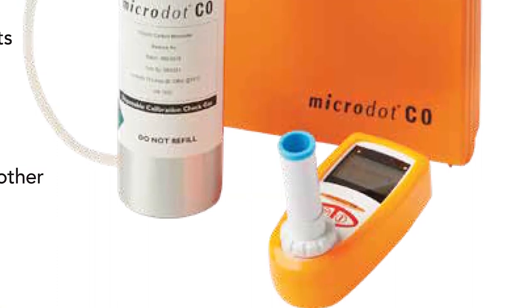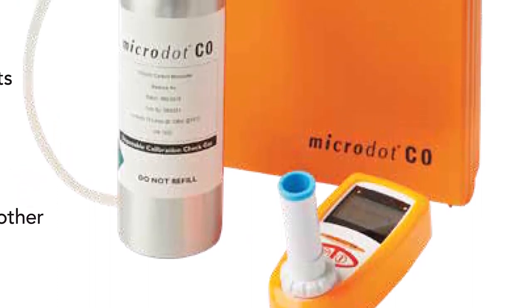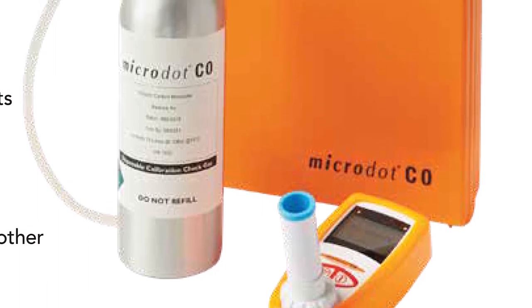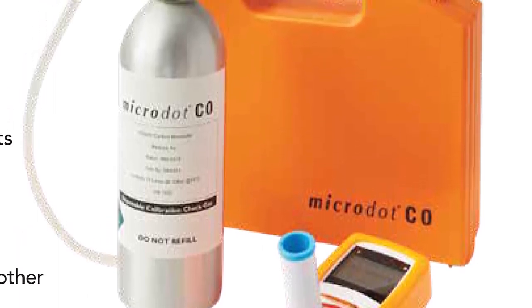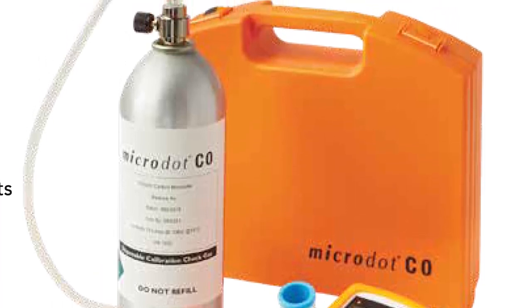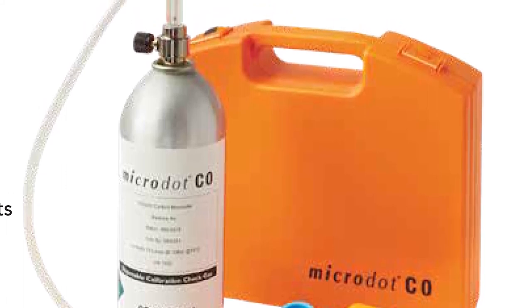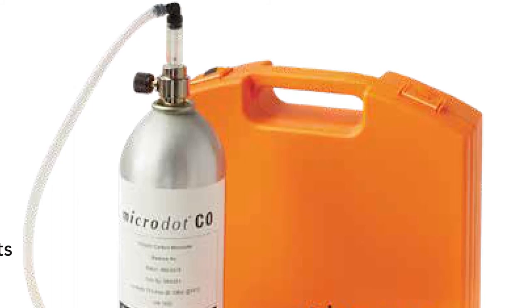Just a few more features and specifications. The unit's accuracy is 0 to 42.5% carboxyhemoglobin or 0 to 375 parts per million of CO. The unit instantly displays results in both carboxyhemoglobin and parts per million. It's for use with generic 22mm EcoStraws and it comes with a 2-year warranty.